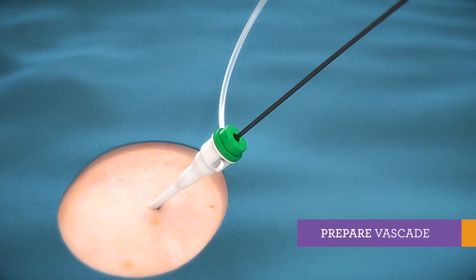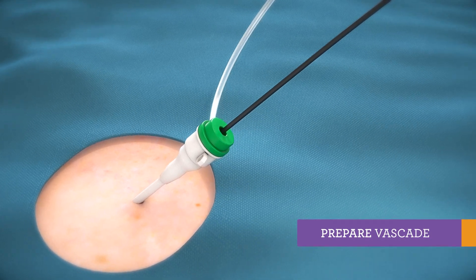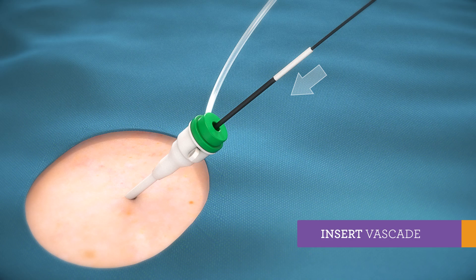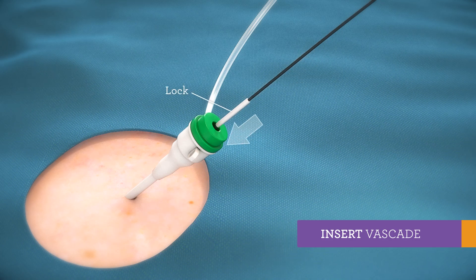Prior to Vascade use, flush sheath with saline and dip device tip in saline momentarily. With short strokes, insert Vascade until lock is midway into hub.